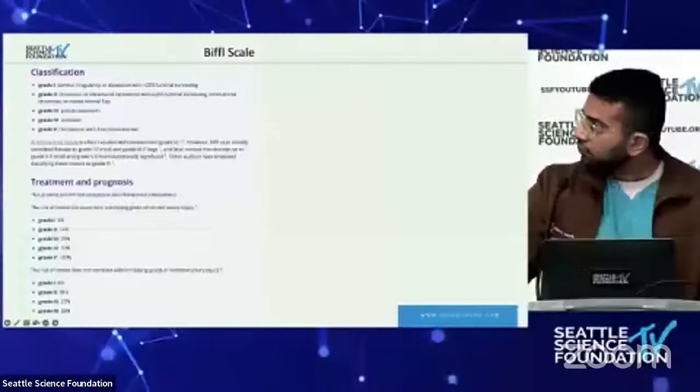I think that's a really important point. And so I personally think that the complications in adult halo vest placements have been crassly understated. My former partner, Rick Bransford, was the lead author on a larger retrospective study from Harborview of, I think, 280 patients, where our complication rate was actually pretty low. But we did have a regular halo service. We put them on that much. And so we had expertise, and we had a fairly stringent protocol, and the patients had to come by every 3 weeks for pin inspections, pin infections being the dreaded most common things.